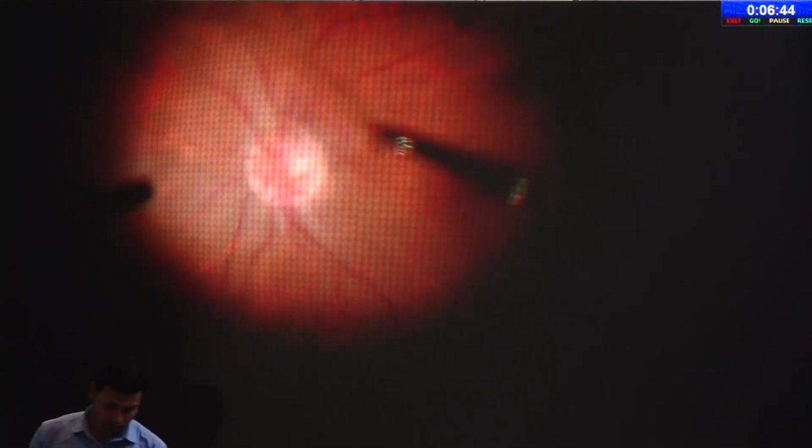So here is a small animation to depict what is done. So, okay, this is a live demonstration. Just go at the optic nerve head and just pull these membranes up like this, and you will get a very proper, good plane of dissection for the membrane dissection.